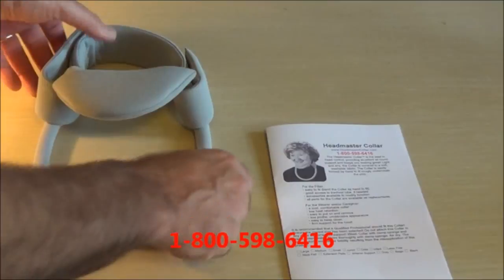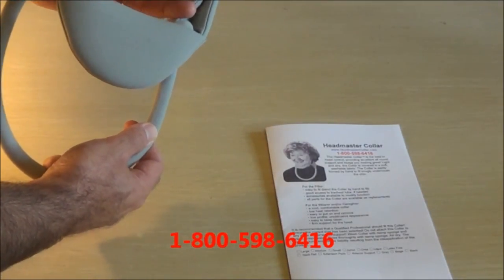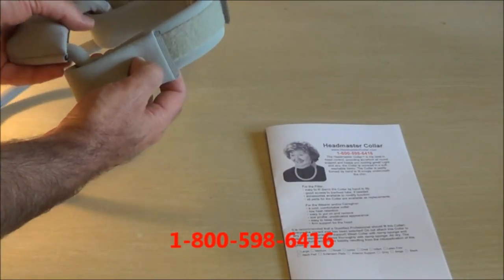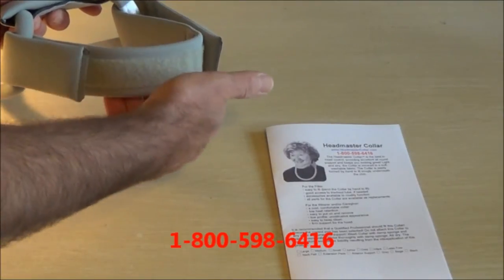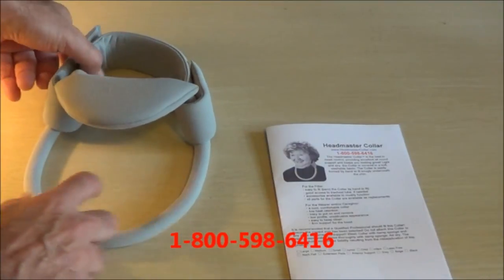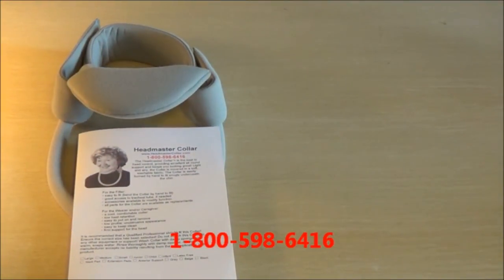Press it down and it will adjust a little bit lower. This way the head and neck fits right in here, nice and snug. For the accessories, like the neck pad and the extension pads, they just attach via Velcro right onto this part. That's how you attach the strap to the Headmaster Collar. From headmastercollar.com, thank you.